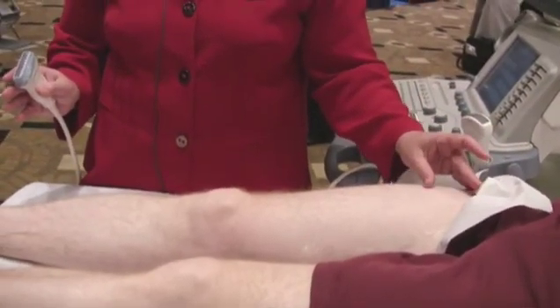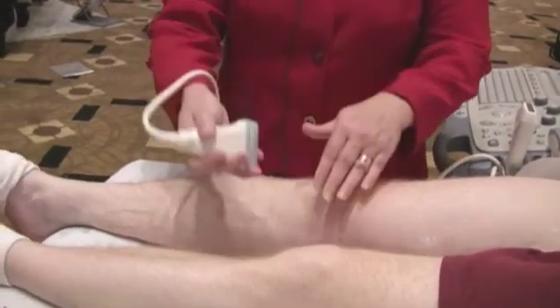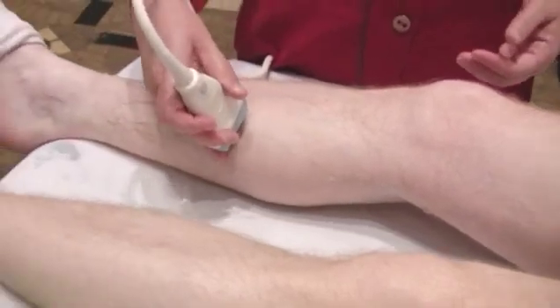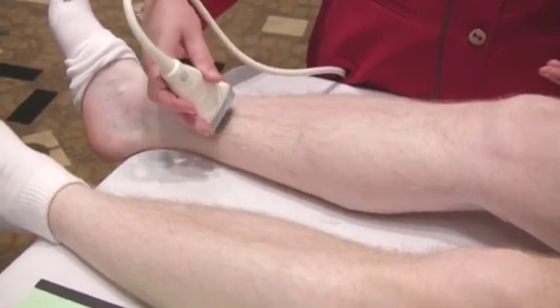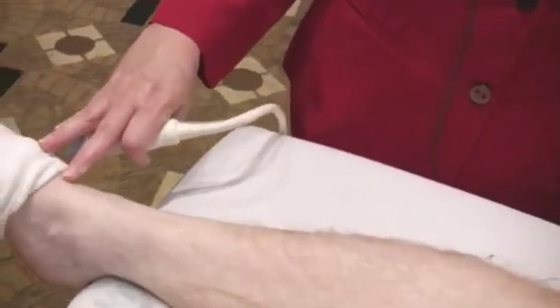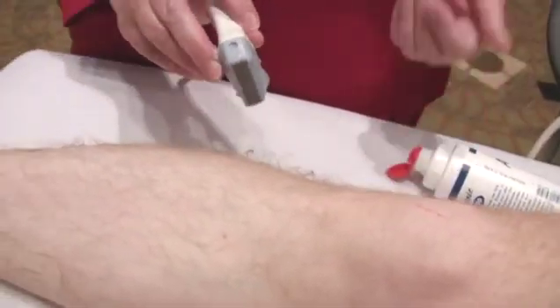Up at the top, we looked at the common fem and the origin of the profunda femoral or deep femoral artery. We scanned through the whole length of the superficial femoral artery. Then we came from behind the knee like this, and we evaluated the popliteal, the takeoff of the anterior tib, the tibial peroneal trunk, and then from a more posterior medial approach in through here, we followed the posterior tibial and peroneal arteries down, following the posterior tibial artery behind the ankle. And then just to wrap it up, we found the dorsalis pedis at the top of the foot and followed it back as it became the anterior tib and continued all the way up to about here, where it dove down away from us to come back up into the popliteal.